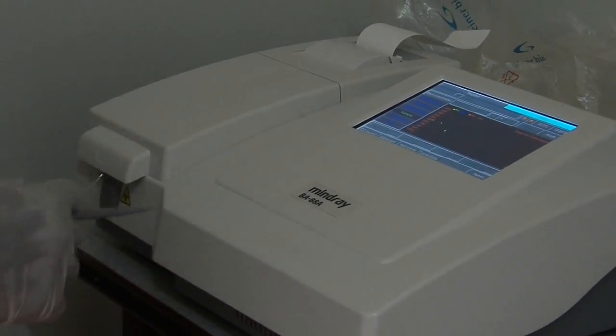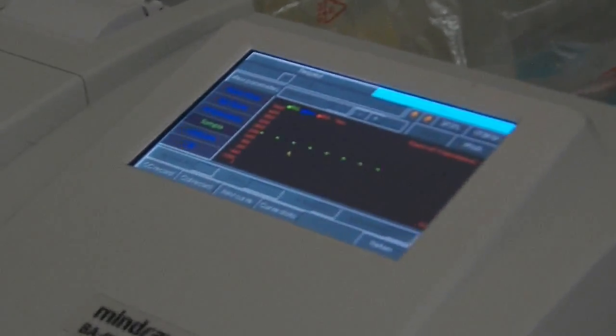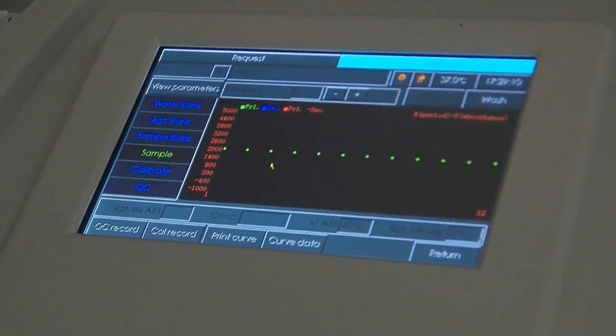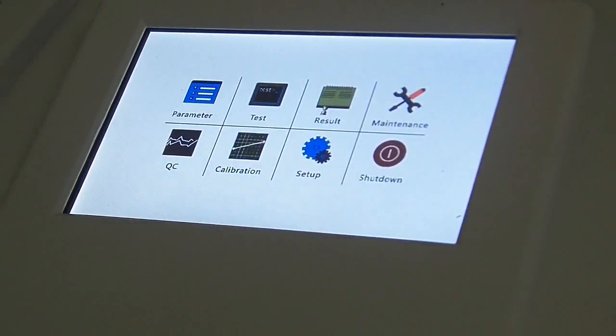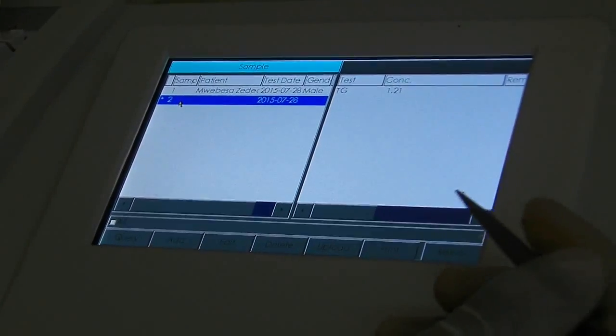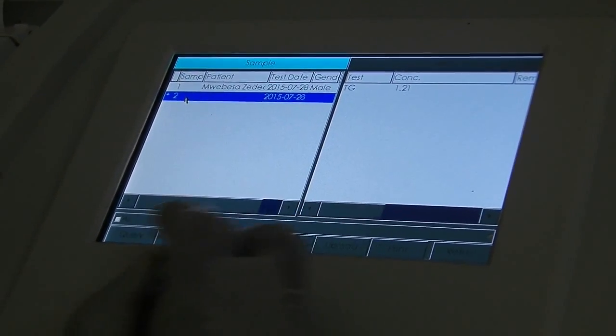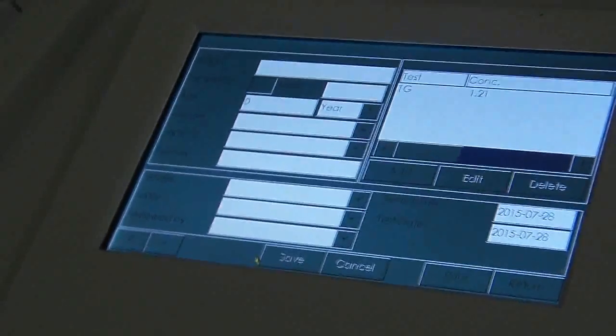There you go — you can see again on the screen. Being a substrate, it takes about 12 seconds and it's ready. Go to results. Remember, I'm using a Mindray. Select the test that you've just run, then you can edit by putting in the details of the patient you are working on. And so, that brings us to the end on how you can run a test on triglyceride and lipid profile.